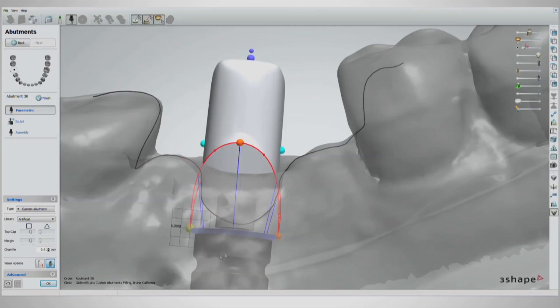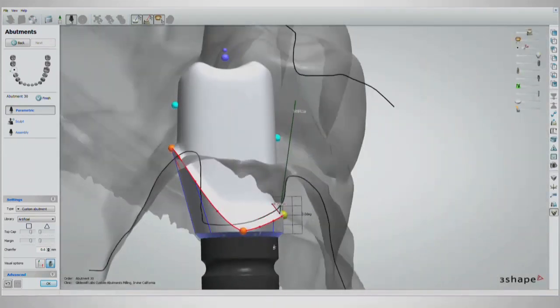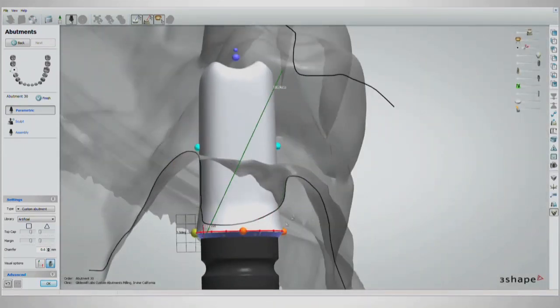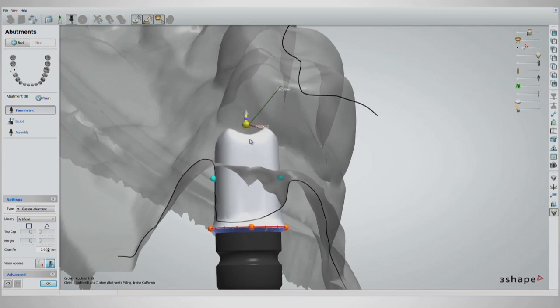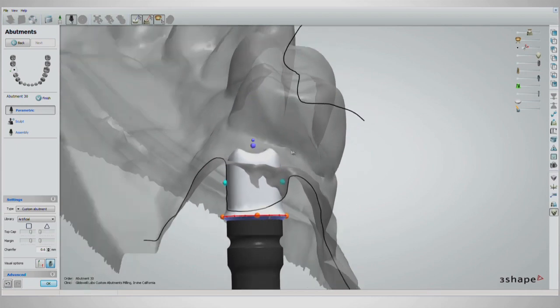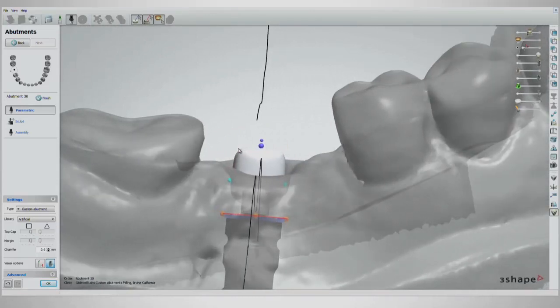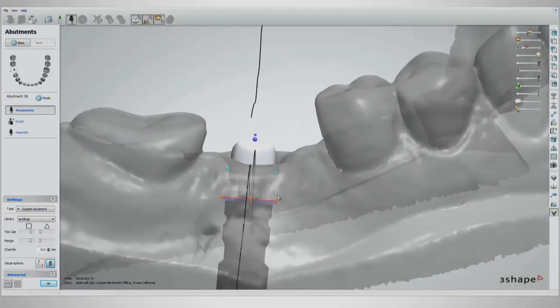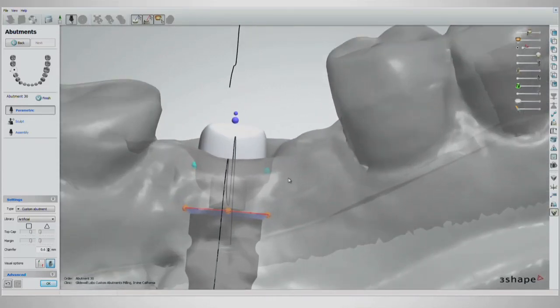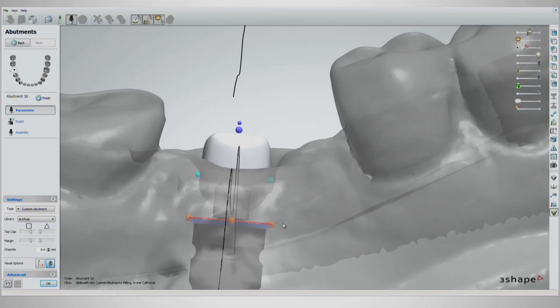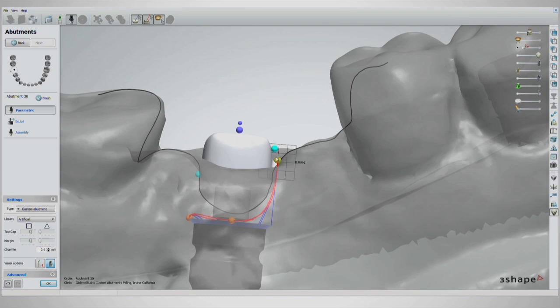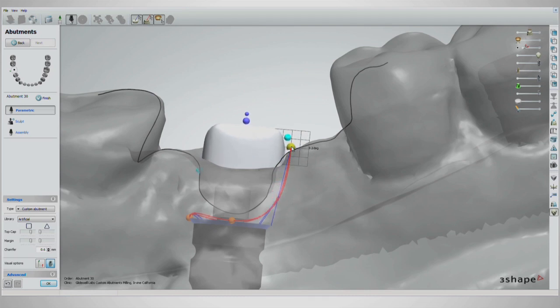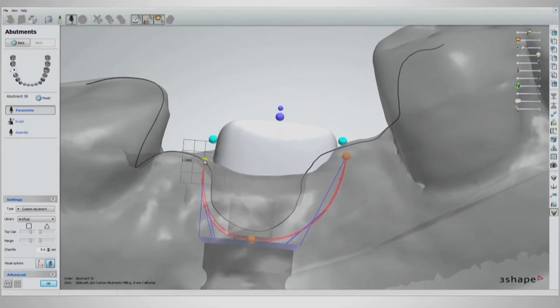Drag all the orange handles down to the implant surface. Once that is done, grab the larger purple handle at the occlusal surface and drag that down as well. This will allow for better viewing of the working area by starting small and building up. Grab the mesial orange handle and drag it up to half a millimeter below the tissue level, indicated by a black line. Do this for the distal orange handle as well.